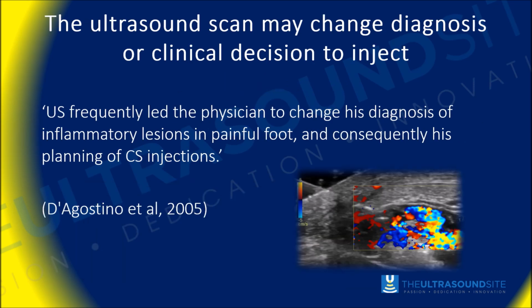Performing an ultrasound has also been shown to significantly change the decision around whether or not to perform an injection. There are studies looking, in this case, at a group of rheumatologists, and quite a high percentage of the time, when they actually performed the ultrasound to survey before performing the injection, they changed their mind whether or not to perform an injection. And I can certainly talk from my experience.